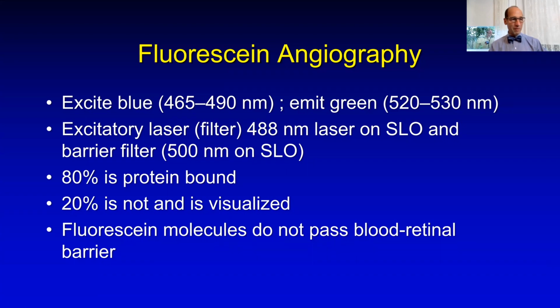Fluorescein angiography, we don't do as much as we used to. We just ran our practice numbers, and I get almost no fluorescein angiograms anymore. But this used to be a big deal, and it's still tested, and it's still important for diagnosis of several retinal diseases. You excite the fluorescein with a blue light, and it emits green. In the old systems, which I don't think any of you will ever see, we just took a camera and flashed a blue light and put in a green filter.